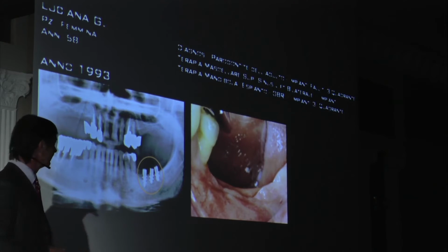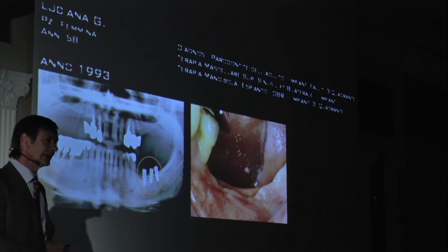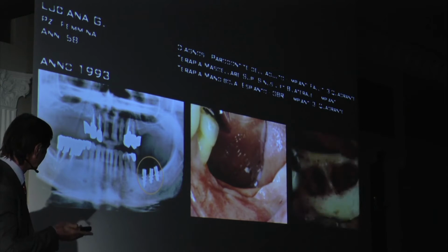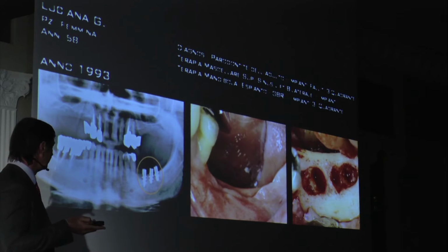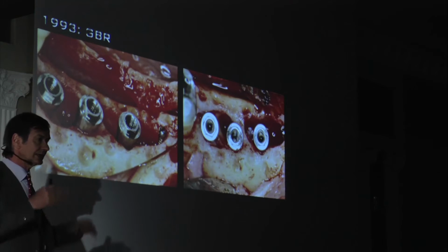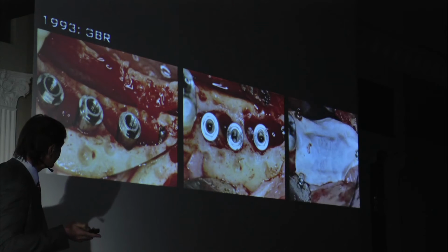And it's very interesting. I did 2 sinus lifts bilaterally. Here she had this kind of typical Italian junk implants of that period that created a huge defect, as you can see here. So in this case, I did the GBR with a little bit of vertical augmentation in this area, using the same implants. And again, I used just the membrane, without a bone graft, just the membrane and the blood clot underneath. You see, the same procedure.